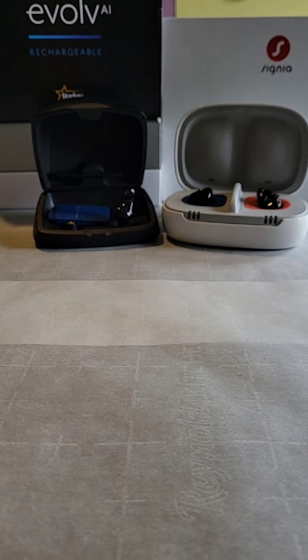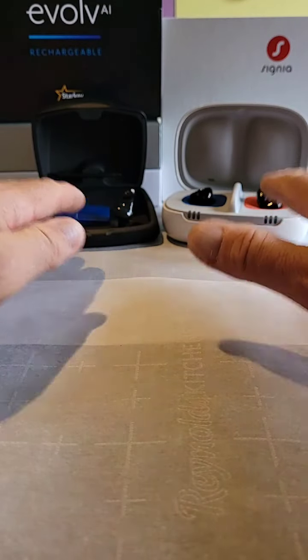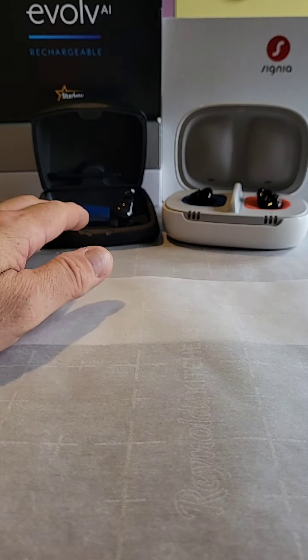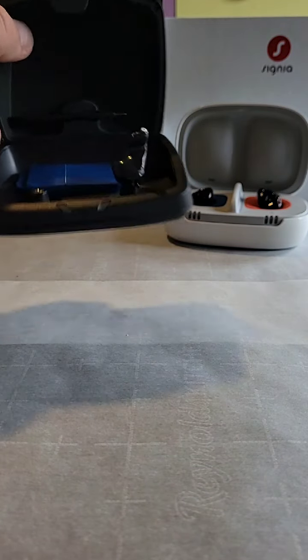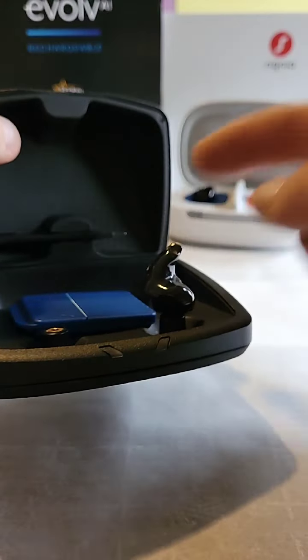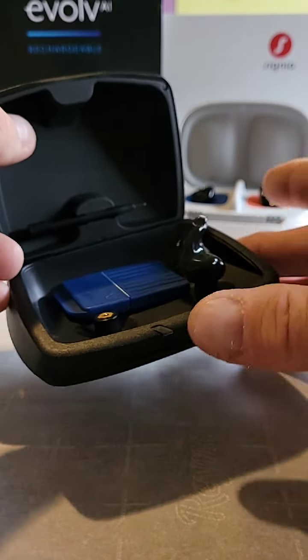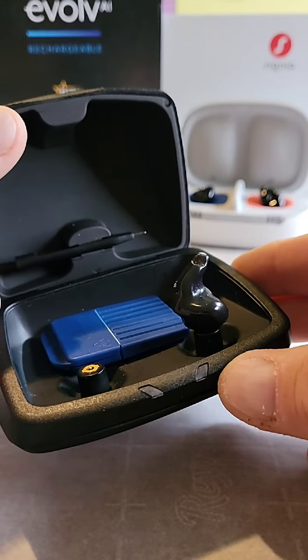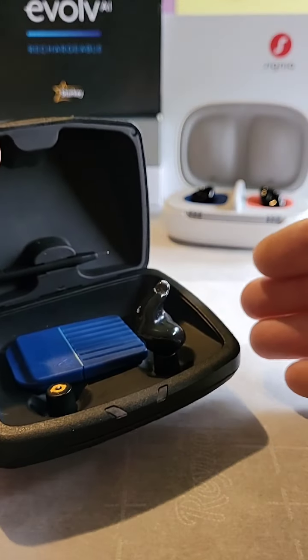And if you watch the first video, I go into more detail about cosmetics and the adapters and things, what I liked about both, and those still hold today on this video. Not going deep into that, but one thing that Starkey has over Signia is their charging unit has room for your filters. The brush is already built in, and you can stick a desiccant bag in there. The unit charges, so you can plug it in, charge it up, unplug it, and it'll hold a charge for 5 days. So if you're just going out of town for 3 or 4 days, all you've got to do is take your charger with you, as long as it's fully charged. You don't need to take the cable and transformer and all that with you.